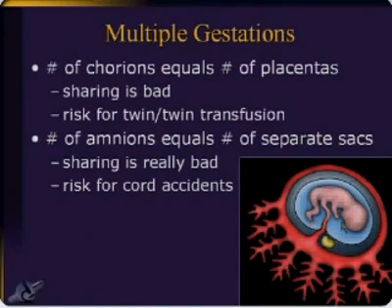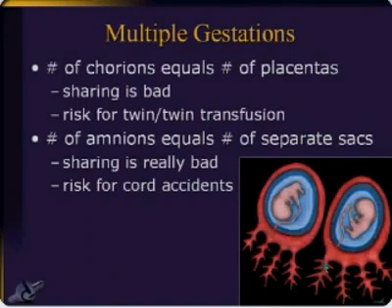Well, if you have to share a kitchen, things can go wrong. So ideally, you want each kid to have its own kitchen, its own bedroom here, and now they have this nice thick wall in between them. So if this guy's playing the stereo too loud, it doesn't really bother that guy very much. They really have very independent compartments that they're living in.